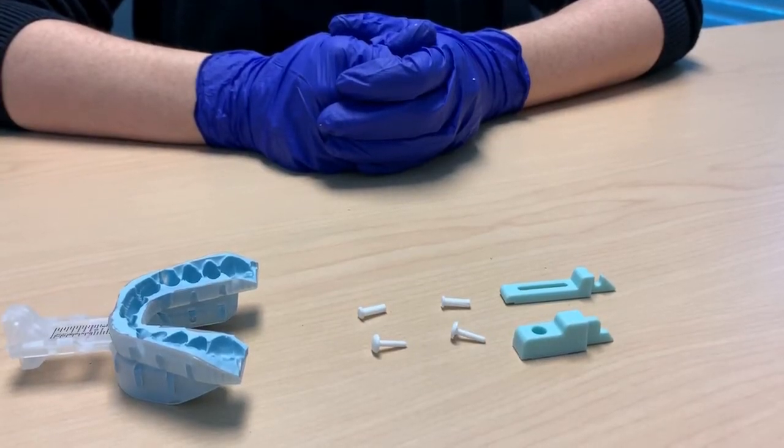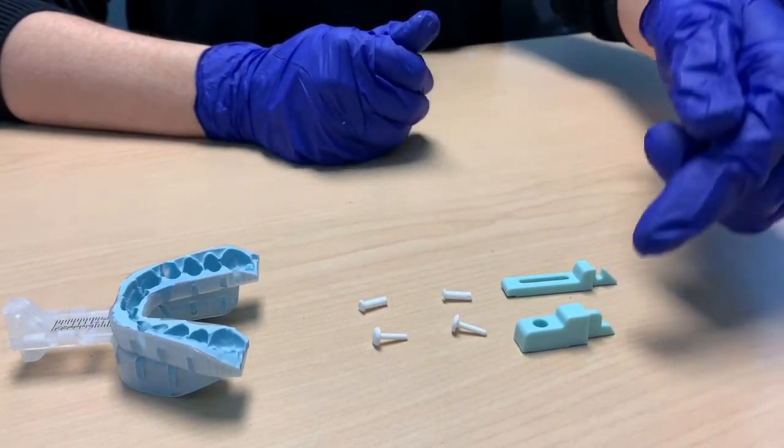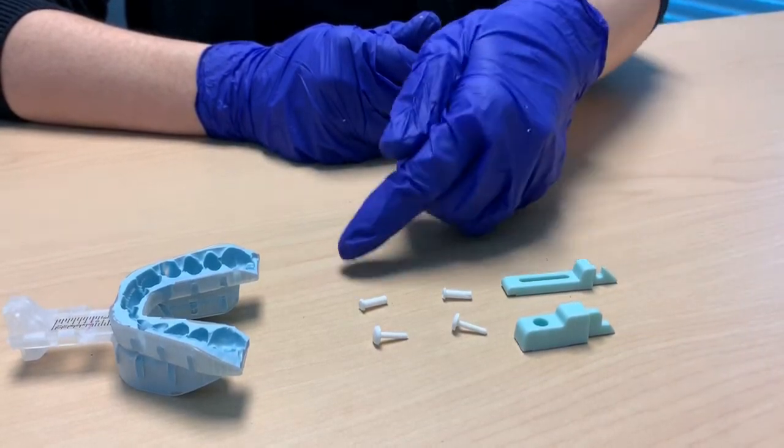Today we'll be walking you through the steps on how to assemble the TD clip. Your TD clip includes the upper clip, the lower clip, and two attachment pins.